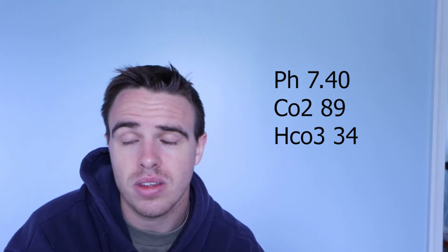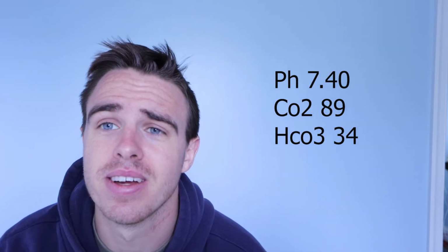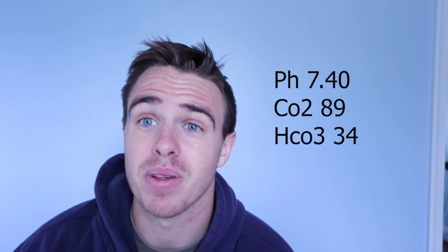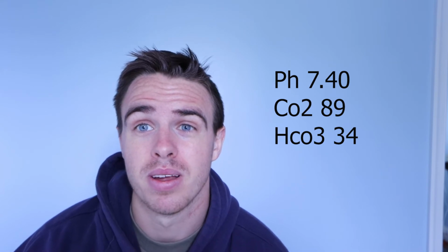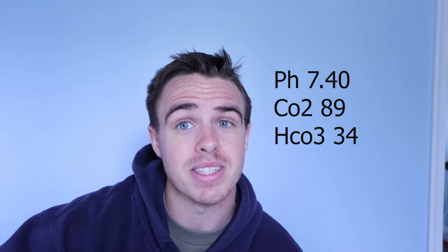Let's look at another one here. Okay, pH looks perfect, right on the dot. That CO2 looks pretty high, and that bicarb looks pretty high. So what the heck is going on here? So pH is normal. CO2 would really drop the pH. That doesn't make much sense. But then we look at that bicarb, and that bicarb would bring it back up. So once again, we see that the CO2 would bring the pH way down low, but then the bicarb is high, which is alkalytic, which brings us back up into that safe zone, which is right on the money.